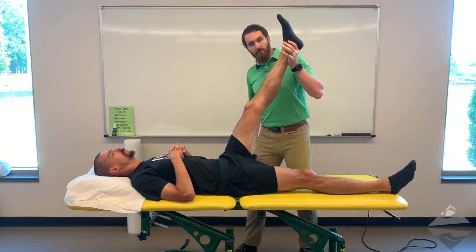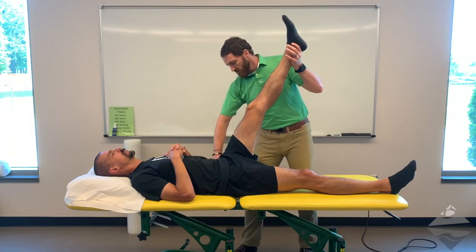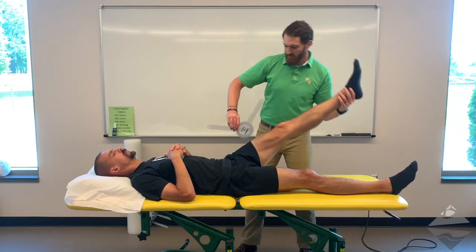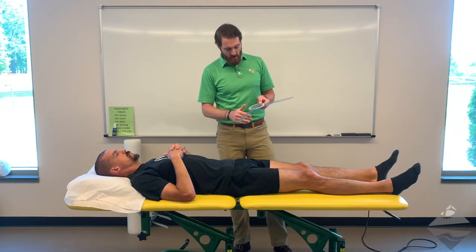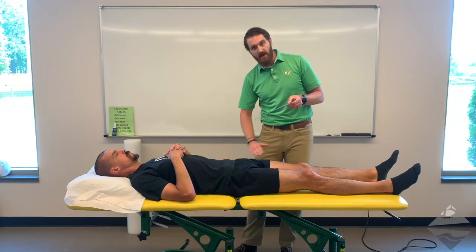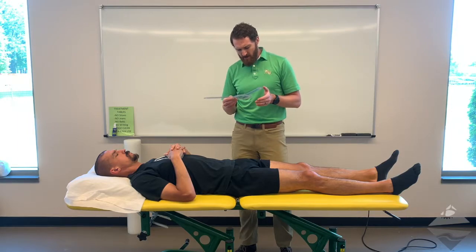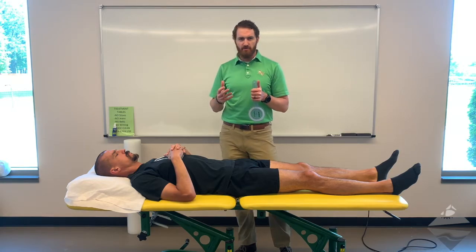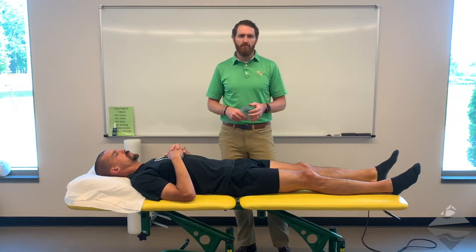Once we get to end range, we can take the goniometric assessment looking at the horizontal to the hip, allowing the individual to relax, and then reading our measurement. The stationary arm is in line with the trunk, and the mobile arm is in line with the midline of the thigh. This individual has approximately 68 degrees of passive straight leg raise. Normative values are around 65 to 70 degrees, so this is functional normal.